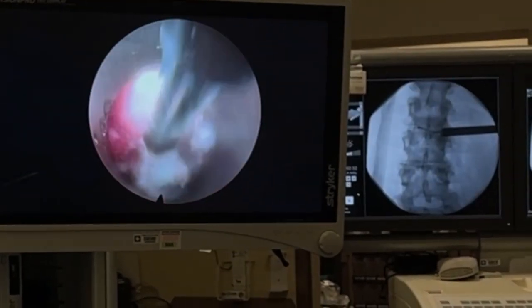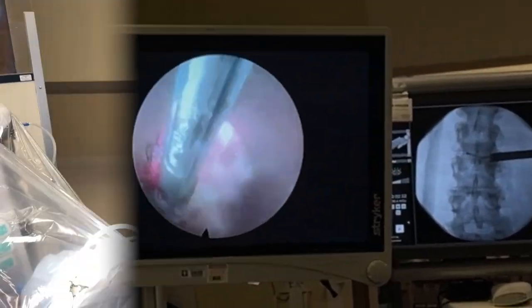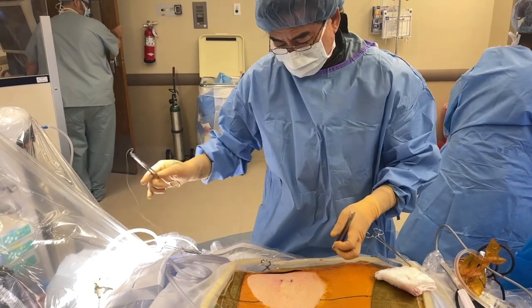Now I'm doing the facet rhizotomy and capsulorrhaphy. Same thing, this looks very inflamed to me. Alrighty, a vampire was in this room.